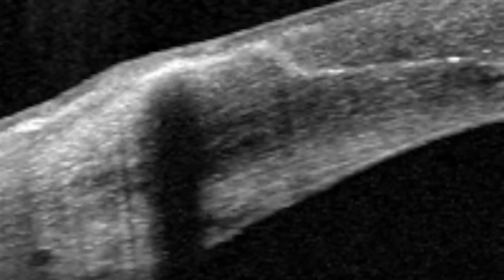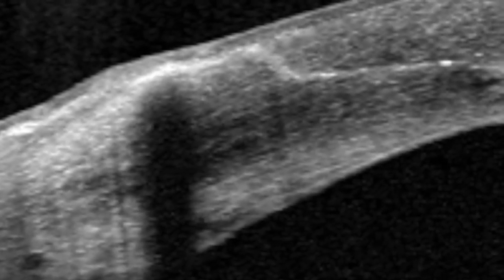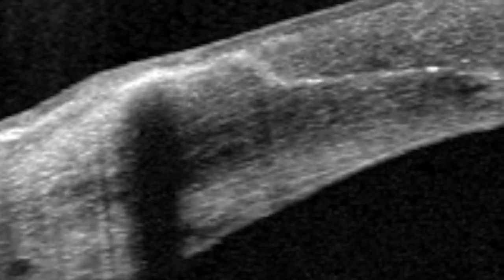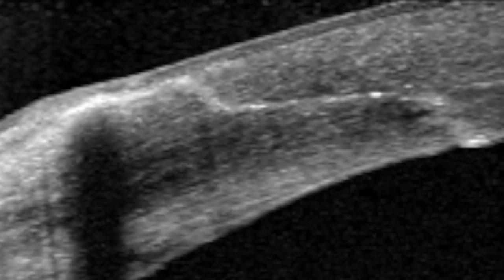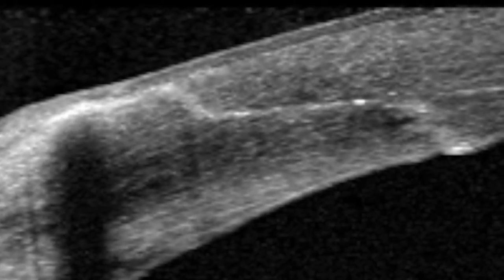This is the final design of this incision. This is an anterior OCT of this incision. We can observe that, even three months after surgery, the incision design is exactly as planned by the device. This design cannot be reproduced manually.